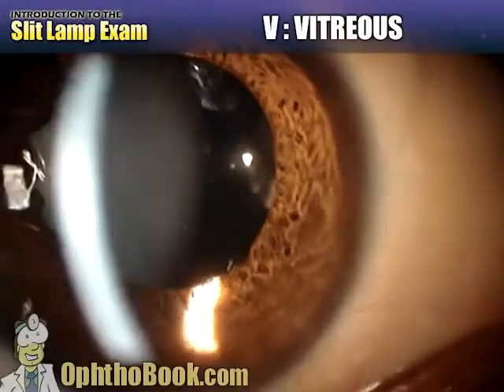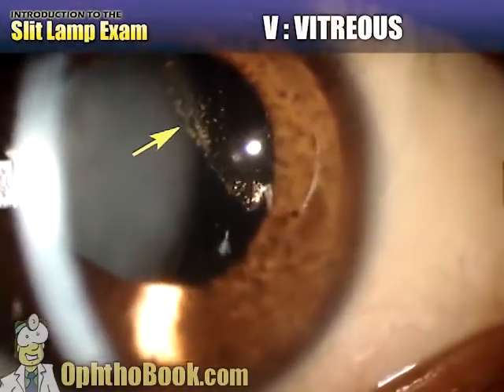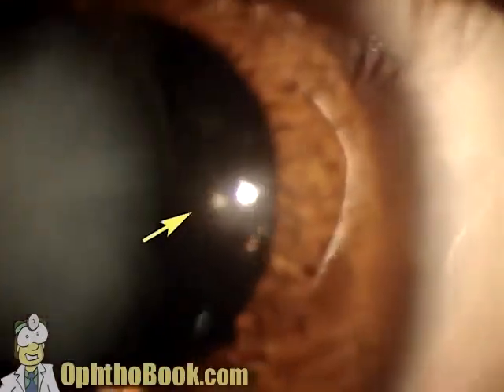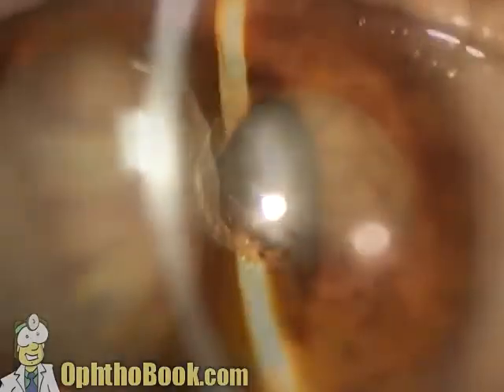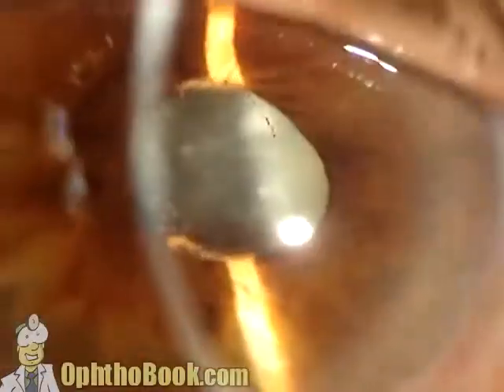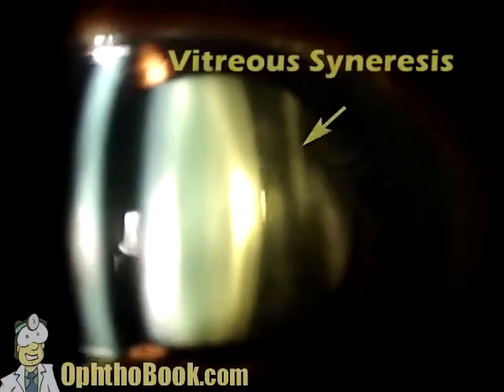This is the vitreous coming around a dislocated lens after trauma, and it has pigment stuck in it. It makes it a lot easier to see that jello back there as it's kind of peeking forward in the front of the eye. Here's another case of vitreous, a big bubble of it right there in the anterior chamber with pigment stuck on it, little spots, makes it a lot easier to see this clear material. But normally when you look back there, what you'll see is something more like this.